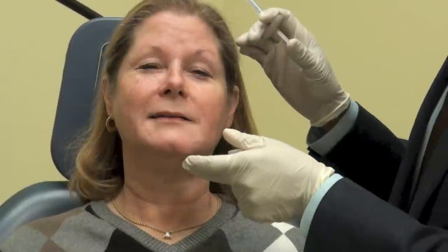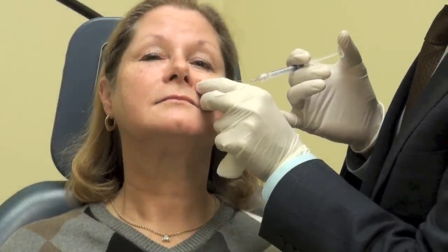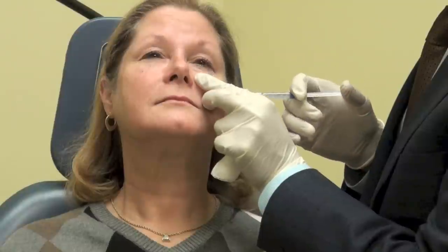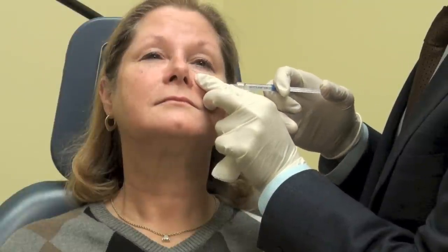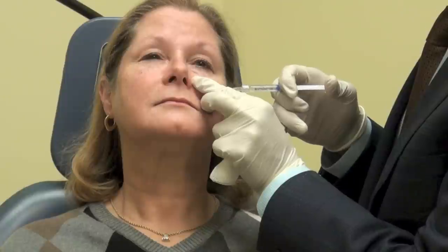So now we're going to go ahead and treat the opposite side. We'll take the cannula just as it is. Those of you who have watched these videos know that I love these cannulas. What these cannulas do is they allow me to fill with minimal bruising — once in a while people bruise, but not so commonly. It's also not super uncomfortable; it's more kind of weird than anything else.